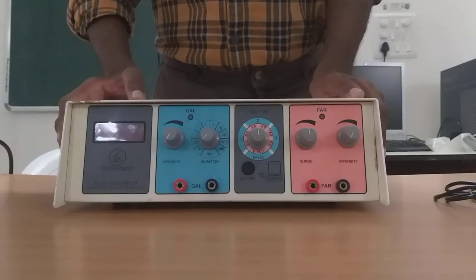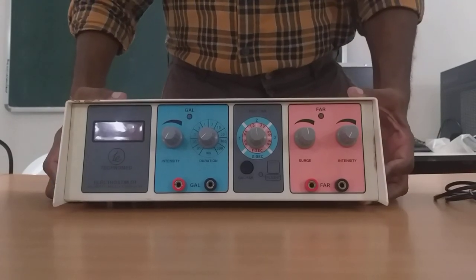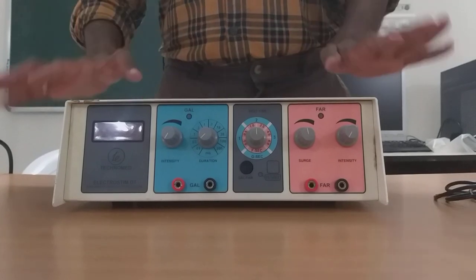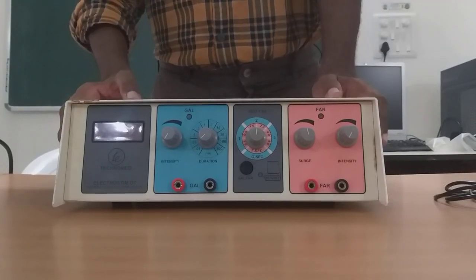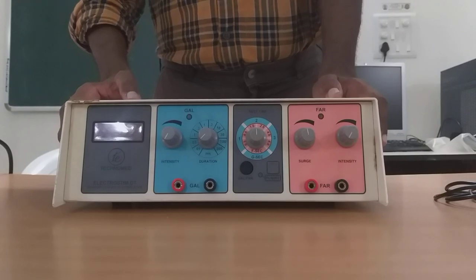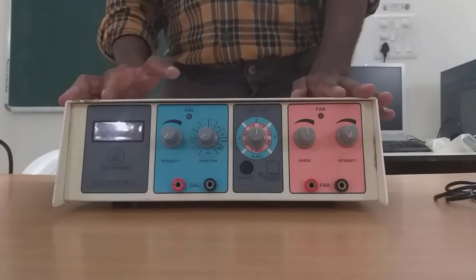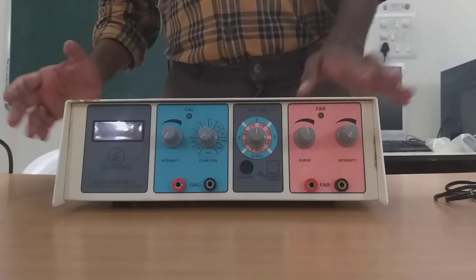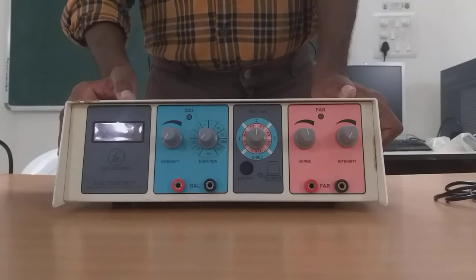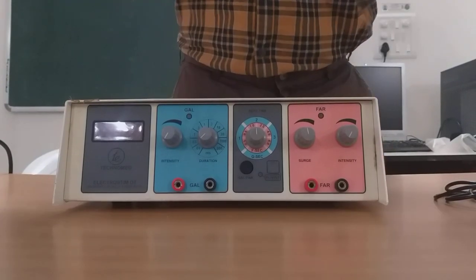Hello all. Today we will be seeing the electrical stimulator. I will be explaining you about this machine. We have completed the panel diagram of this machine, so I will be correlating this machine with the exact panel diagram that we were having. To be very precise, this is an electrical nerve muscle stimulator and this is a diagnostic stimulator.